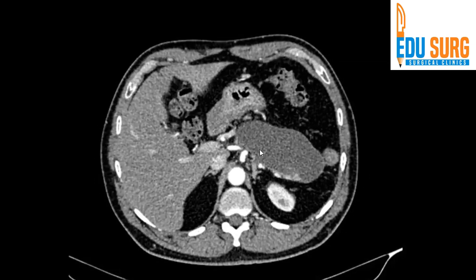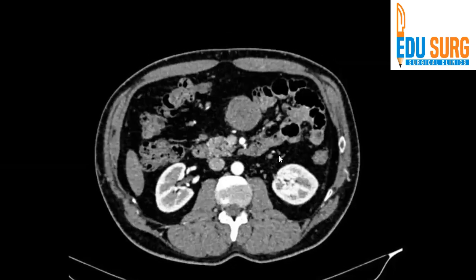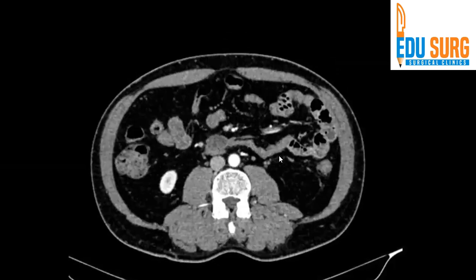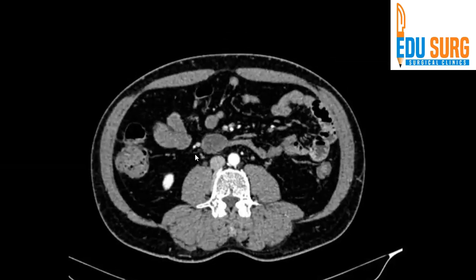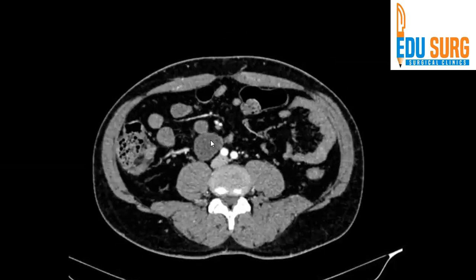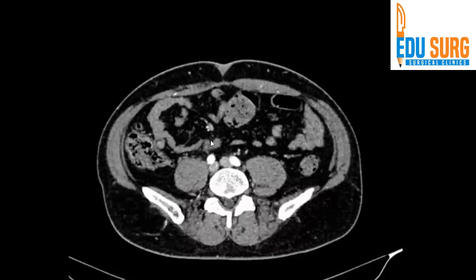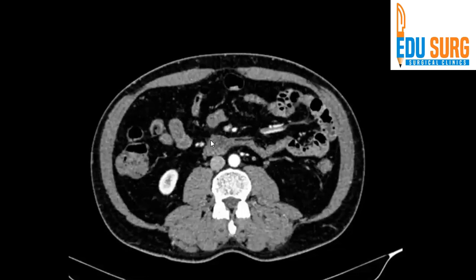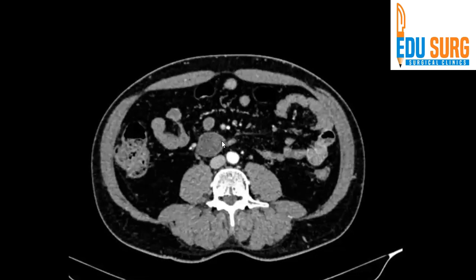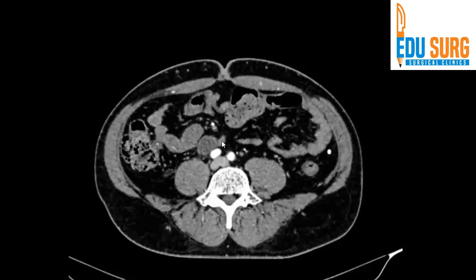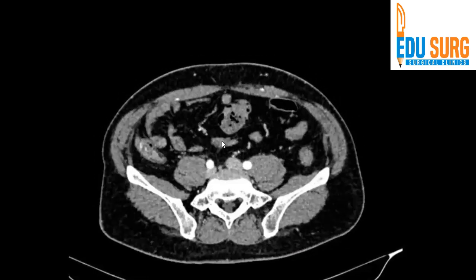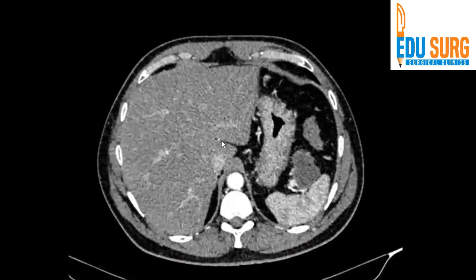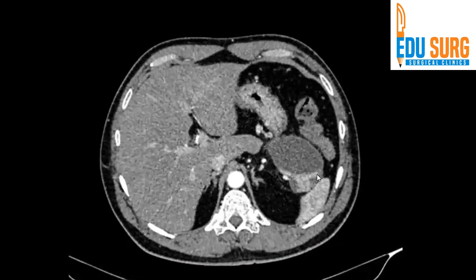If you have identified the collection, that is good, but there are some important additional points to identify. There is a separate small collection in this area — that is something that should not be missed, because if this patient is planned for surgery, this collection may also need to be tackled. That is one point that is often missed in a scan like this.